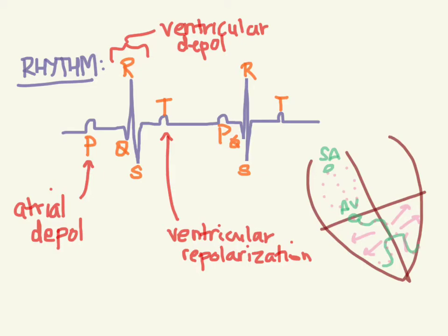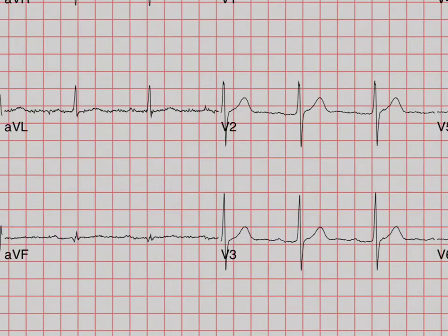So now let's look at what that looks like on a real EKG. Let's look at this in V3 here. We got our P, there's no Q, but you got the R, then the S, and then the T. And then you got your P again, the R, then the S, and then the T. So if you have this morphology - P, Q, R, S, T - then we call that normal sinus rhythm.